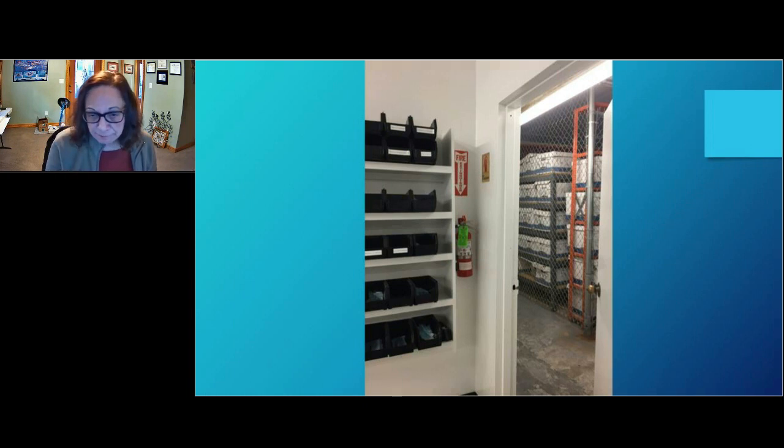So this was a place I went to that actually processed instruments for several dental practices. This was just an instrument processing area. It was in the basement of a building, and you can see the door is open here, and you can see what's out there is just general junk. It's files and whatever behind the wire fence.